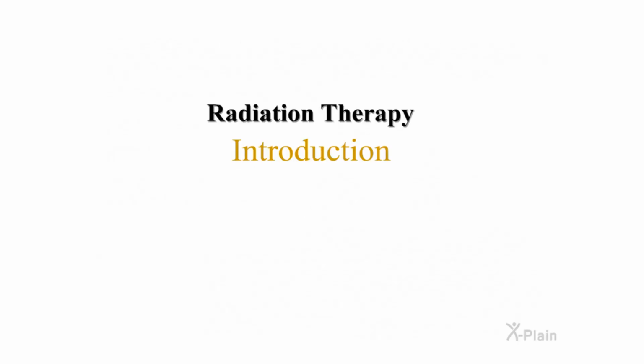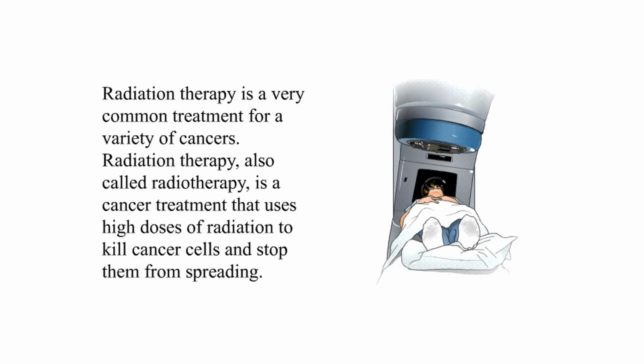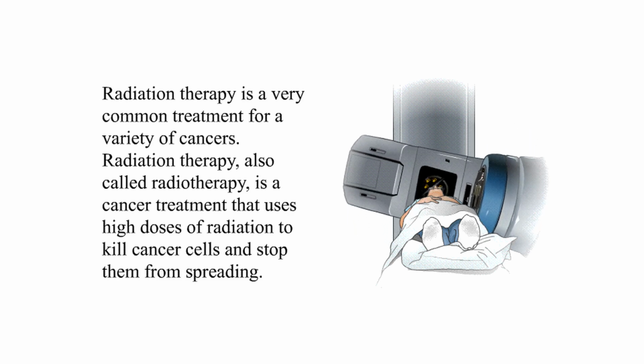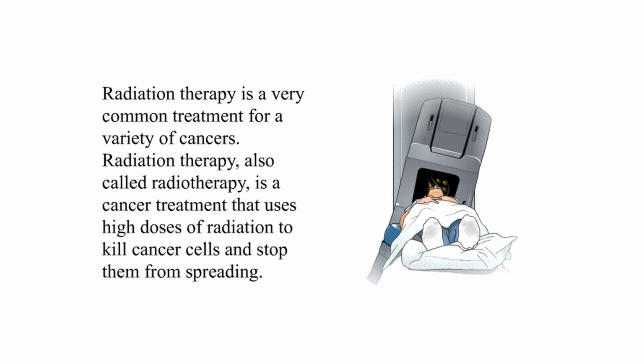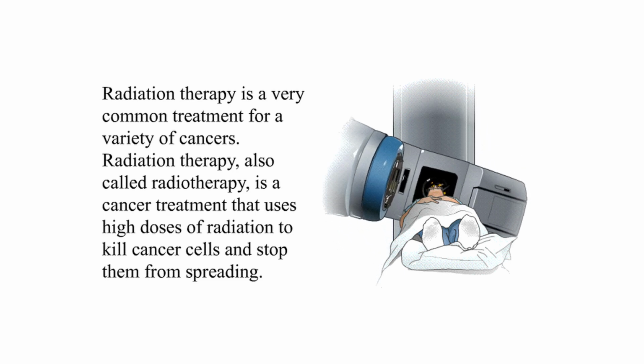Radiation therapy. Introduction. Radiation therapy is a very common treatment for a variety of cancers. Radiation therapy, also called radiotherapy, is a cancer treatment that uses high doses of radiation to kill cancer cells and stop them from spreading.